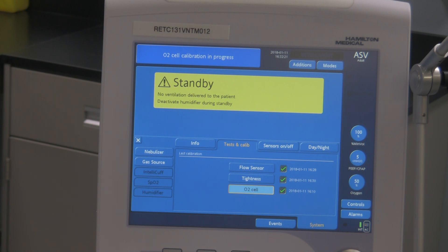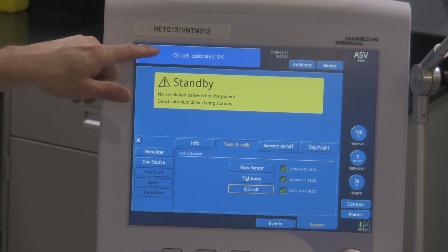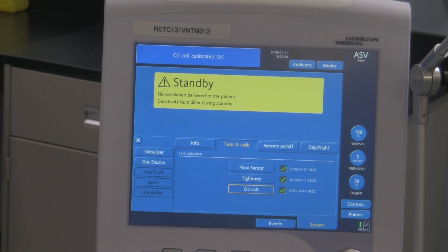I hope that this calibrates in time here. Yay! It says O2 cell calibrated OK — so it's good. We passed all three tests: checkmark, checkmark, checkmark, today's date, and the actual time that the test was done. This is good to go.